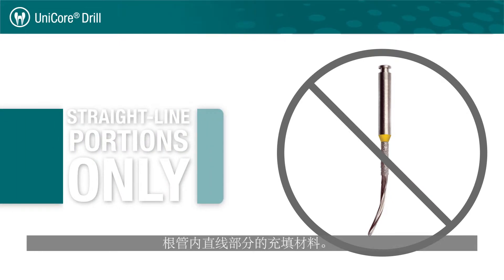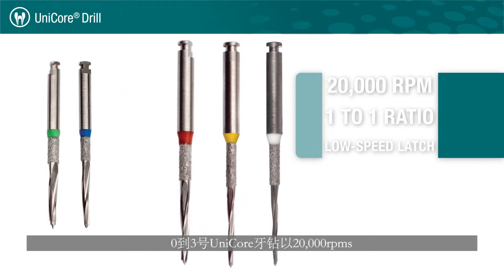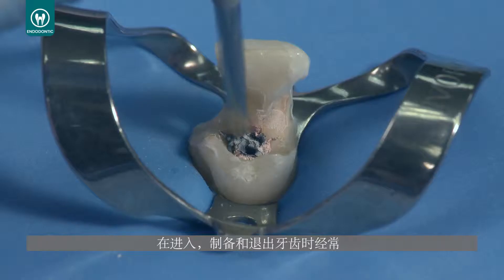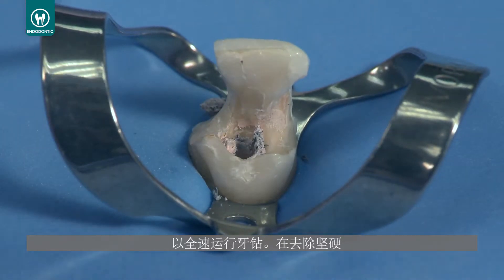The size 0 to 3 Unicore drills run at 20,000 RPMs in a 1 to 1 ratio low speed latch. The size 4 Unicore drill is the only one that runs at 5,000 RPMs. Always have the drill running full speed while entering, preparing, and exiting the tooth.